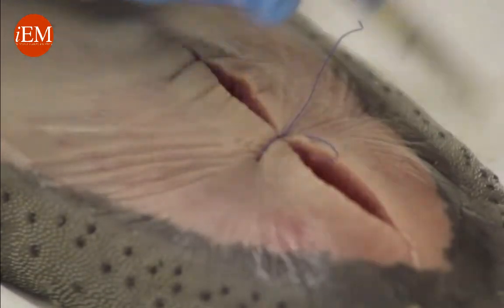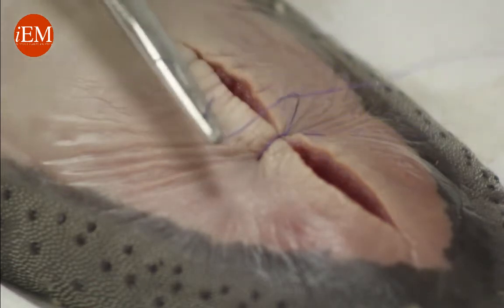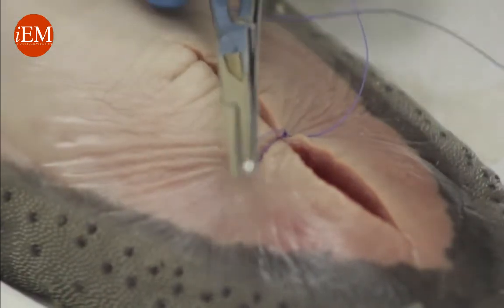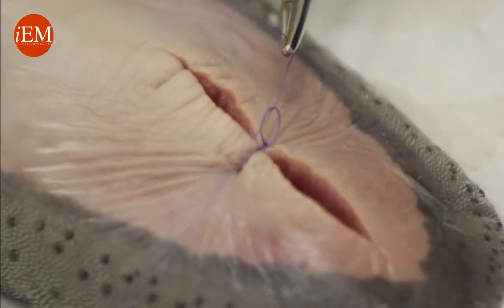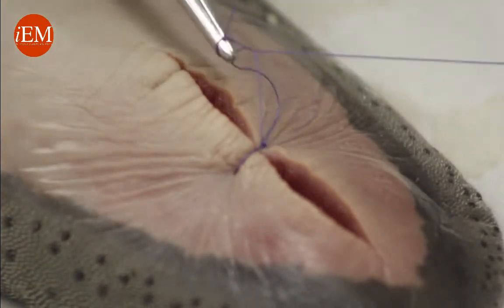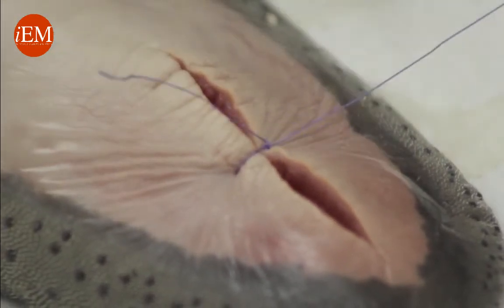Now we go for our square knot and we need to come back. See how I cross my hand — see how it lays flat in the middle. Wrap it once, and see how I come down flat. I'm going to do it one more time — wrap once, grab the tip, always grab the tip, and pull evenly on both sides so it comes down flat.